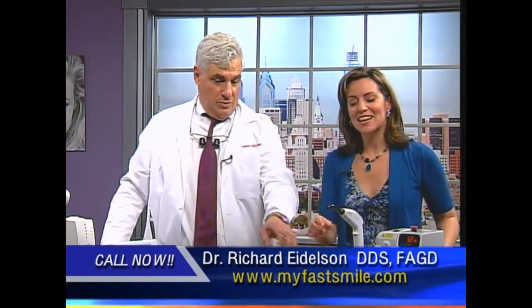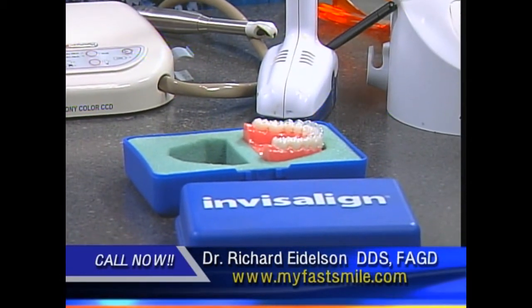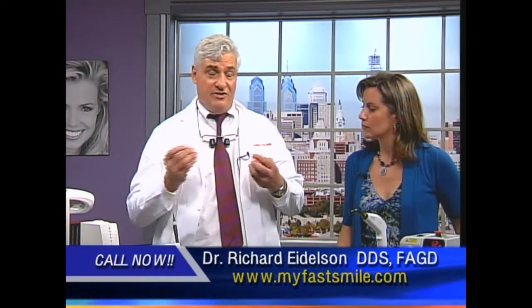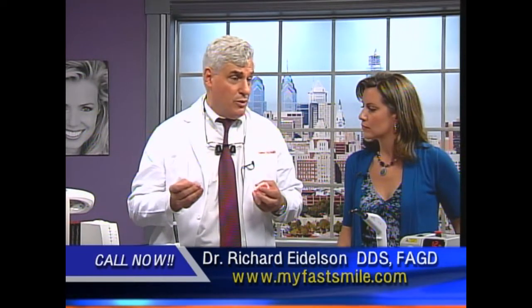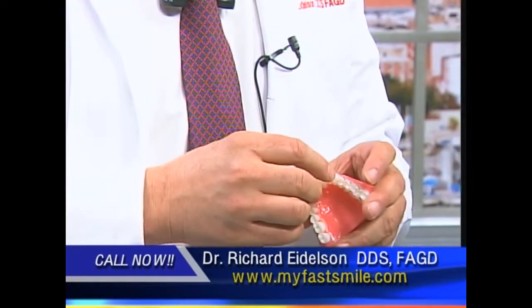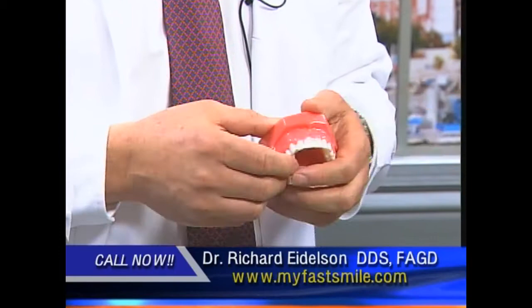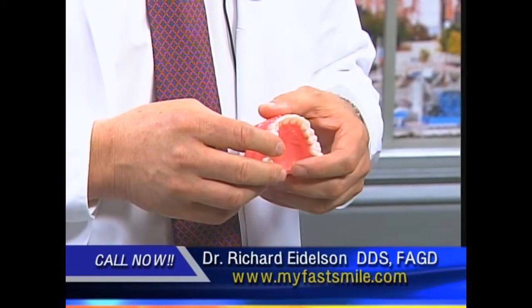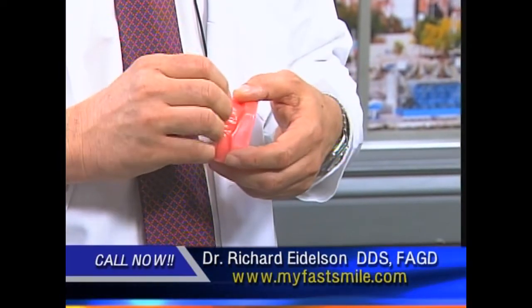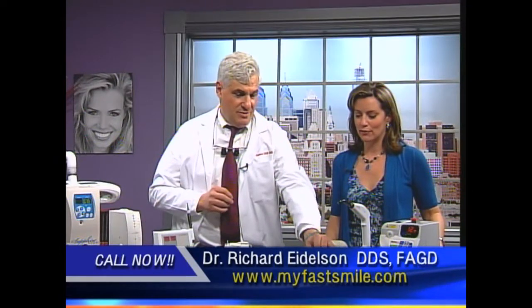And then Invisalign, they look familiar to me. How do they work exactly? What do you have there? Well, it's all about computers and high tech. Once again, we take an impression of the patient's mouth. I design everything with Invisalign in a computer. A patient actually sees an animation, and they get these little retainers. If you put them on the teeth, you can't even see them. And you wear a new one every 2 weeks. In a period of less than a year, most of my cases are 7 to 8 months, the teeth are straight, and it is absolutely one of the most amazing areas of dentistry in the last 4 to 5 years. What a difference, no longer having to have the metal on the front of your teeth, huh?